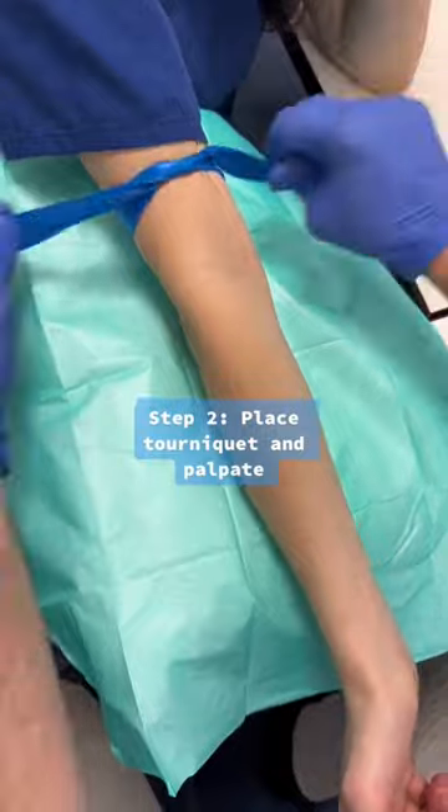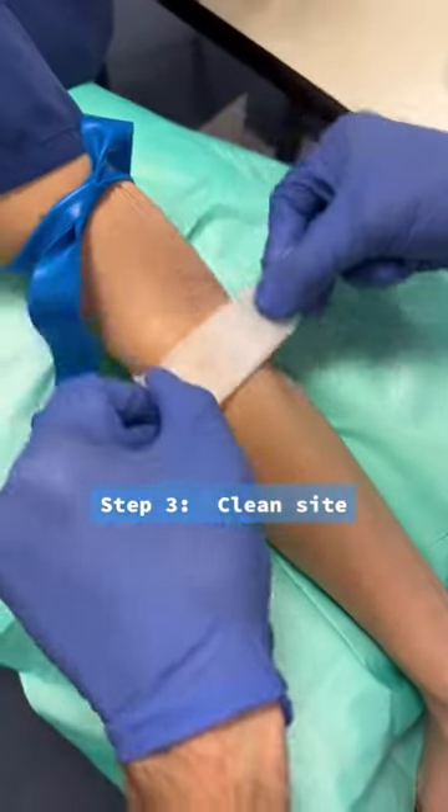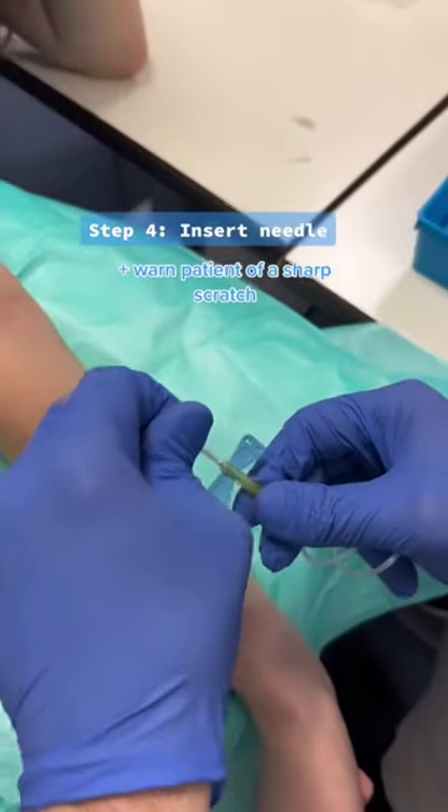Step number two, you want to place a tourniquet just above where you want to insert the needle and palpate for a vein. This should feel a bit bouncy under your skin. You then want to clean the site with an alcohol wipe — here we use the crosshatch technique.